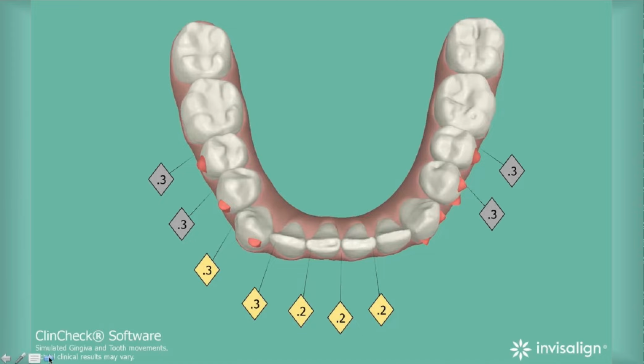All of those yellows, and the teeth are about as straight as they can get. They're kind of odd-shaped teeth in some ways, and they're not very regular. So in some cases, you're making a little judgment about the best position. But you're not doing IPR until the teeth are straight. Otherwise, you're making it hard for them ever to resolve.